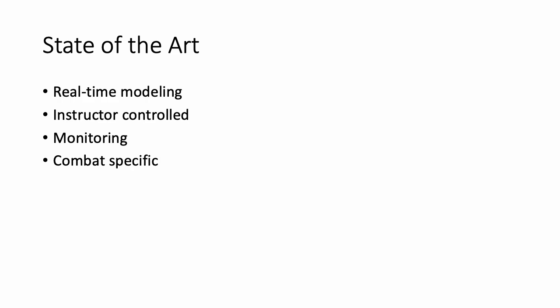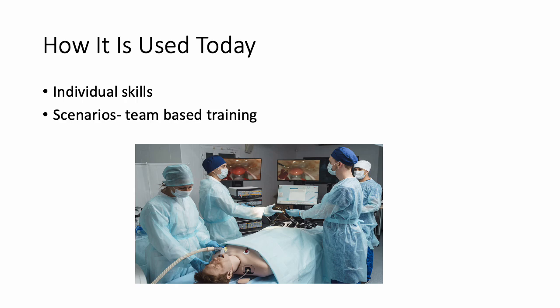The medical procedure simulators also have monitors that show heart rhythms, oxygen levels, and vitals, where learners have to interpret the data like a real patient. Many of the simulators utilized in the military show combat injuries like hemorrhage, airway obstruction, and pneumothorax. Recent research has shown that TBIs will need to be considered more than ever in our next fight due to advanced technology. This is something that will need to be added to medical procedure simulators when training our military healthcare personnel.